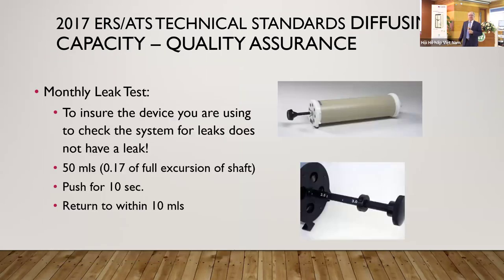There is a described leak test for the syringe itself, because the 3-liter syringe is used as a mechanical model, so they just want to make sure that it doesn't have a leak, because that's what you're trying to evaluate. I'm not going to go through how this is done. It's just described in the document itself.